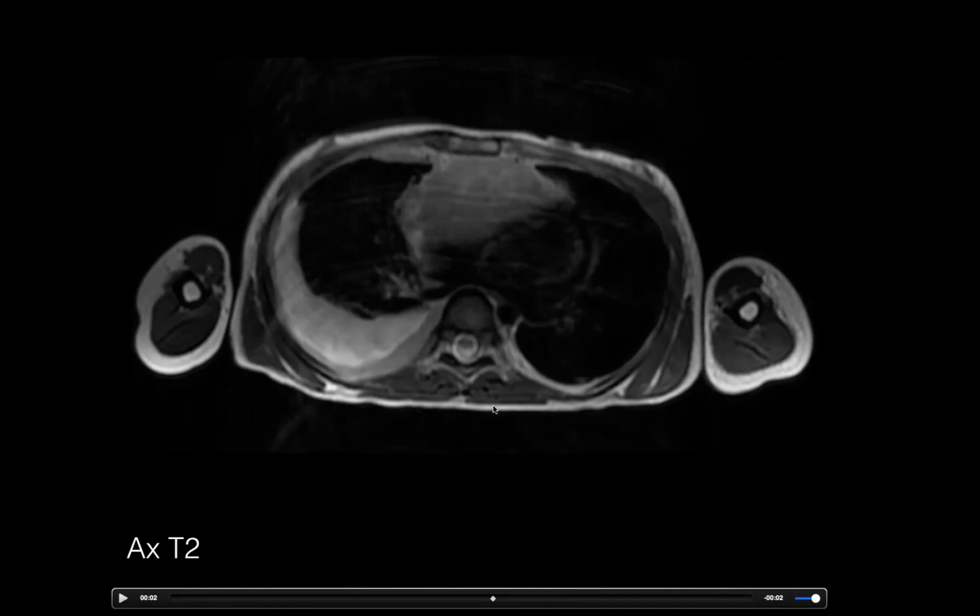The other thing is that another indicator is phase encoding. Usually you want to apply it in the thinnest dimension, and readout, which is not limiting your field of view, is the longer dimension. So the readout is right, left, because you can see how much coverage you need here versus anteroposterior for phase encoding, and that's the direction you see the ghosting from the wall of the chest. And so the anomaly here is quite striking.